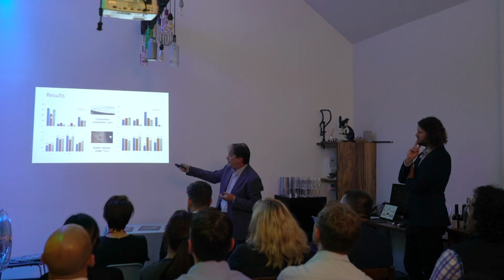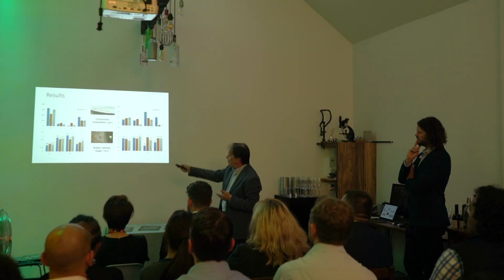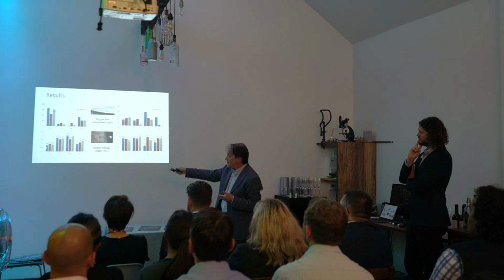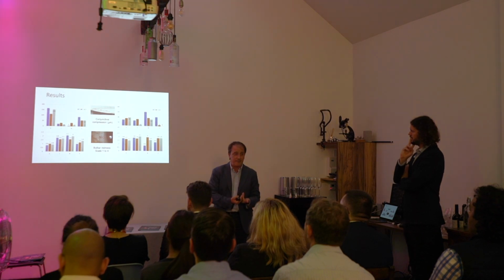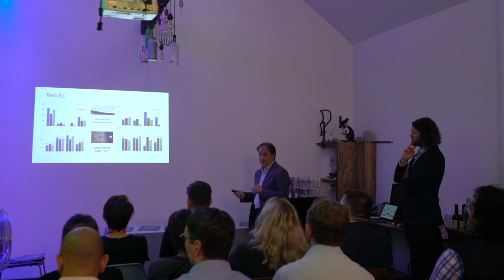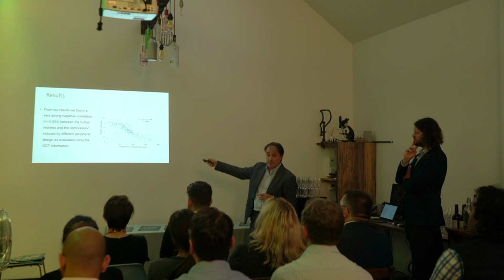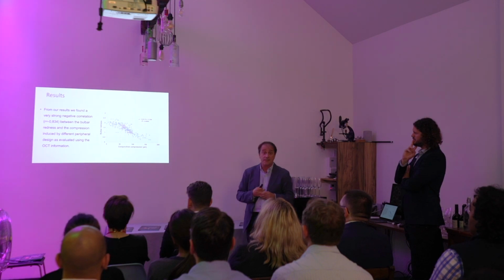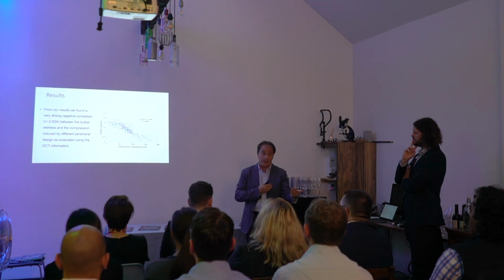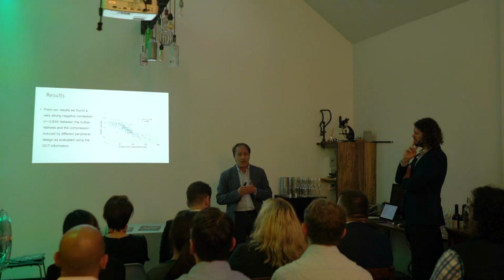And as you can see here, where we have the higher compression, as here and here, we have the lower redness, so the areas were more clear. But this was not enough, and we also plotted the changes in the bulbar redness with the conjunctival compression. And as you can see here, the result was very interesting, because there is a very high inverse correlation between compression and redness. This was just with the lens on.